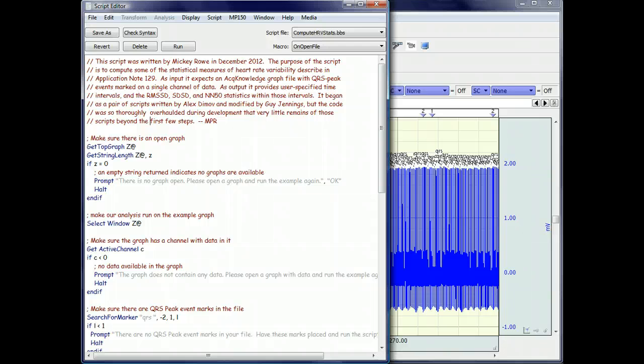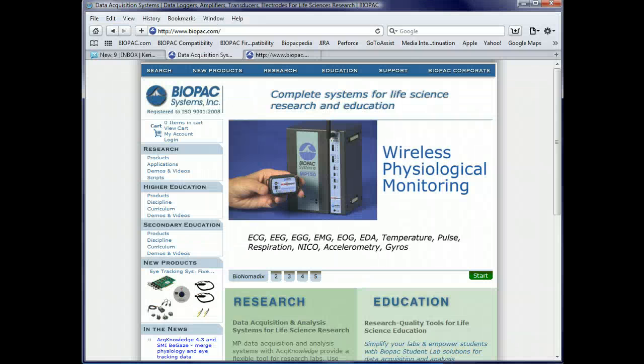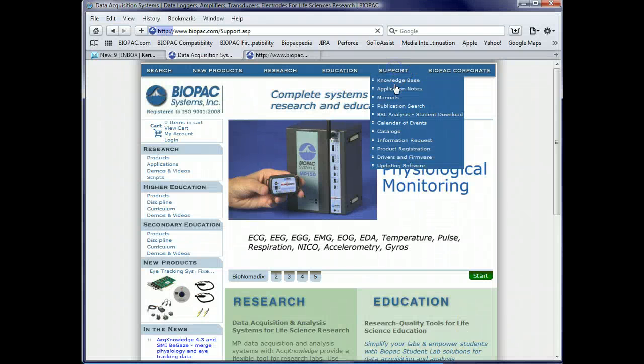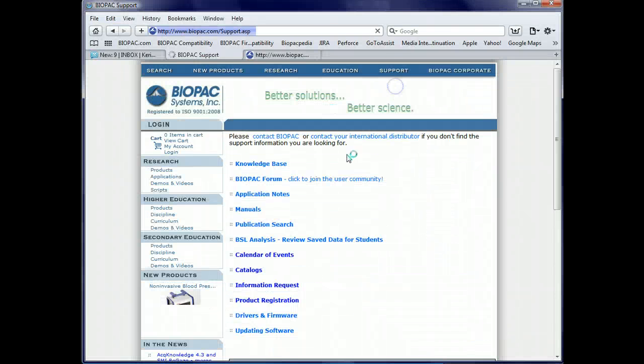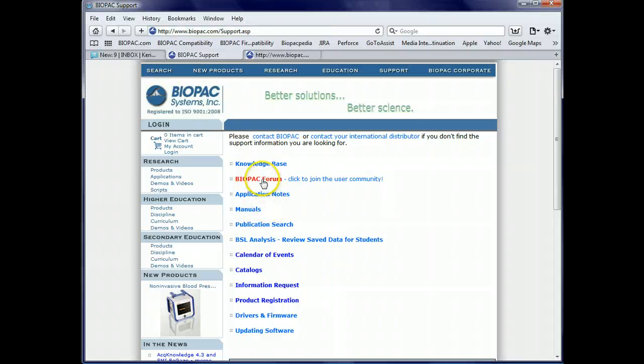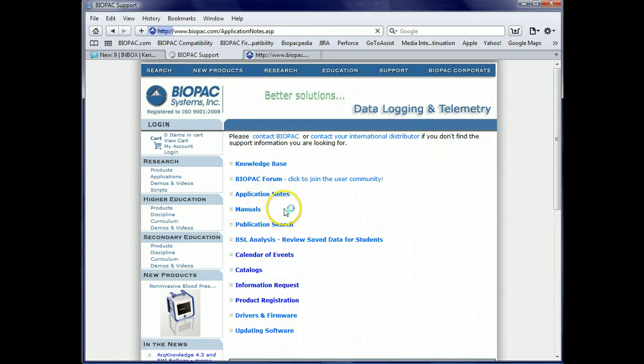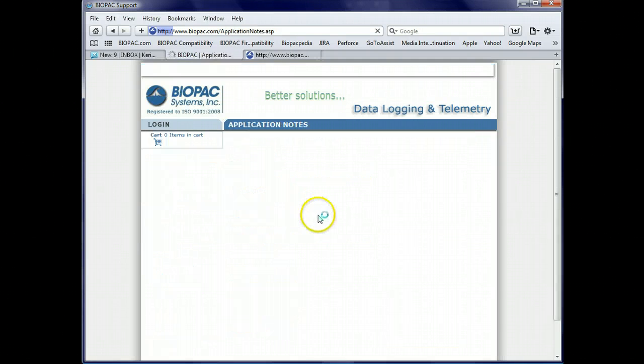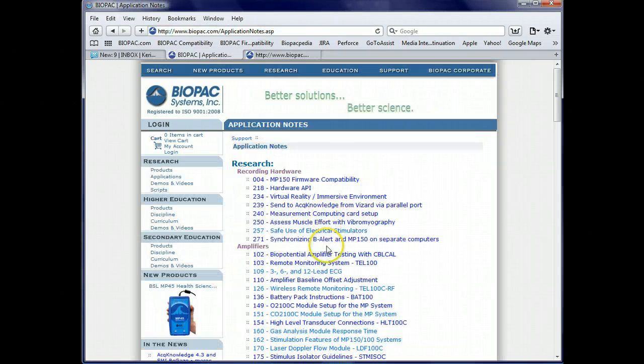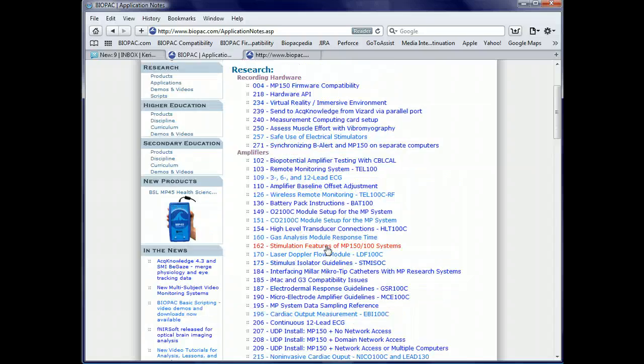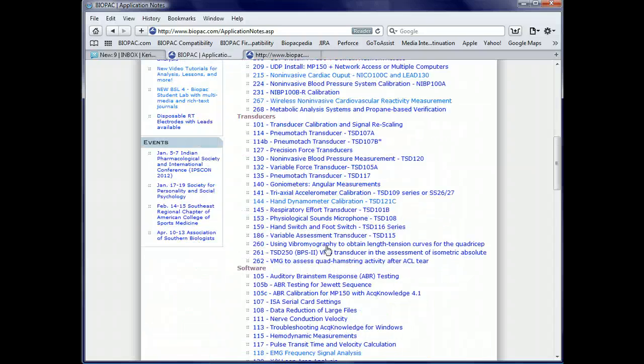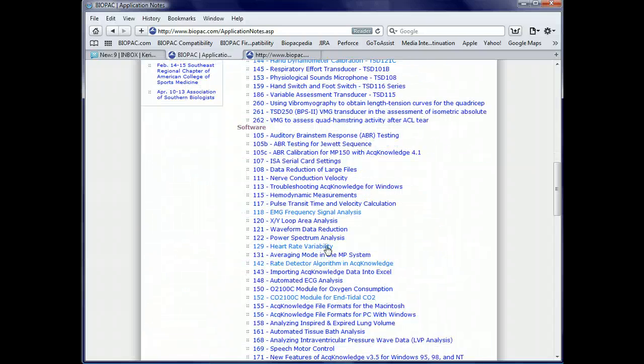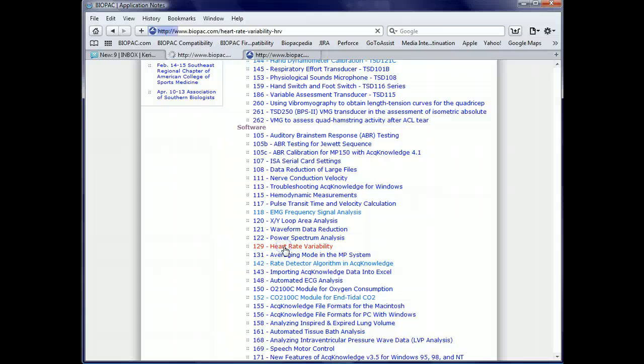The statistics are described in an application note, specifically application note 129, which you can find listed under software on our application note space.